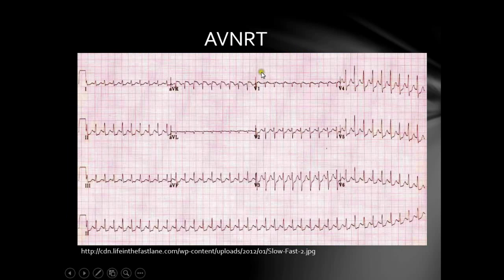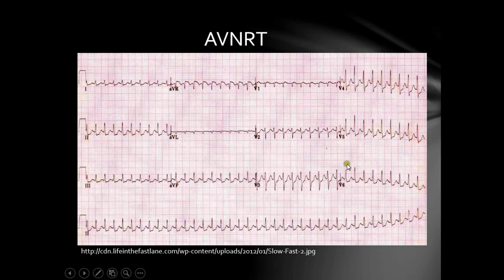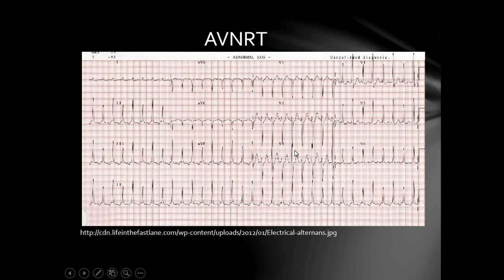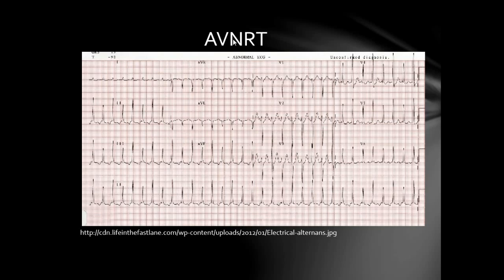In the AVNRT example ECG, there is a regular rhythm with rapid narrow complex tachycardia at about 220 bpm, no visible P waves anywhere, and widespread ST segment depression. In a second example of AVNRT, the same findings are present along with QRS alternans — the QRS complexes vary in their amplitude. There are multiple subtypes of AVNRT, but these are the major ECG characteristics.